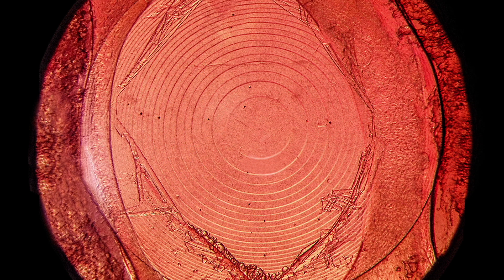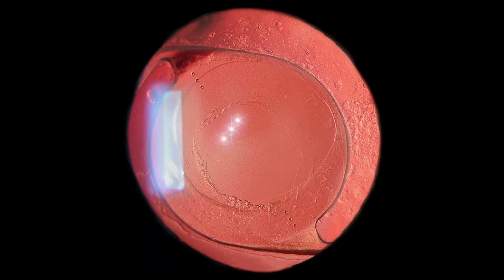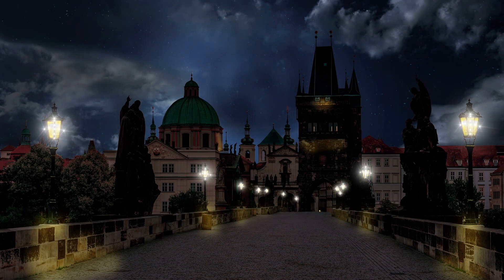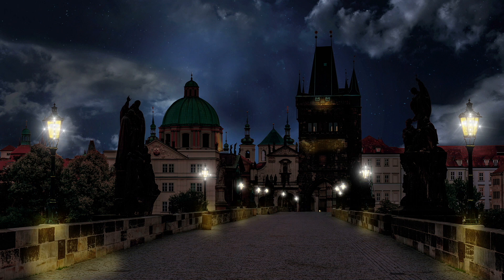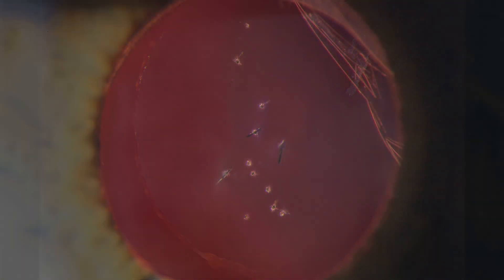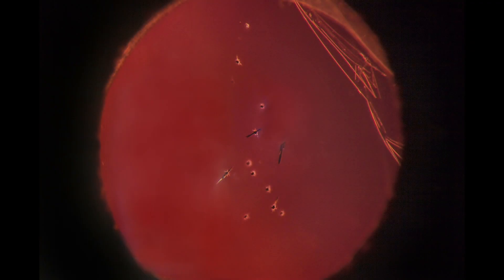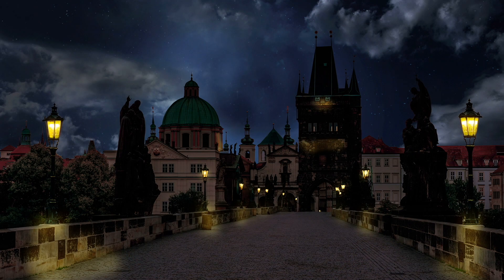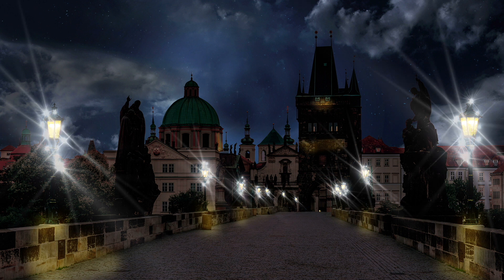Care must be taken to aim the laser beam carefully to avoid pitting the optic. IOL pits in the optical axis can lead to disturbing light effects. This lens has certainly lost all of its premium properties. As a result, the patient may well have to suffer with this for the rest of his or her life.